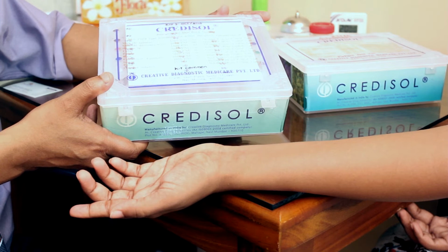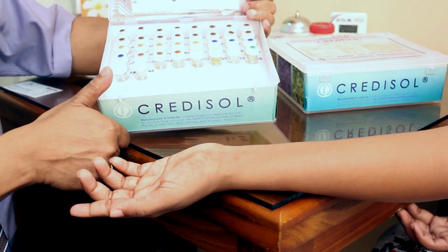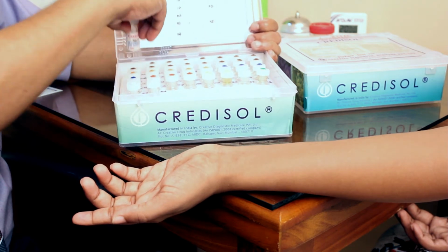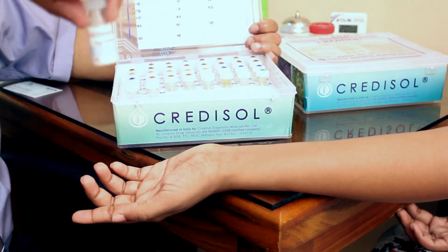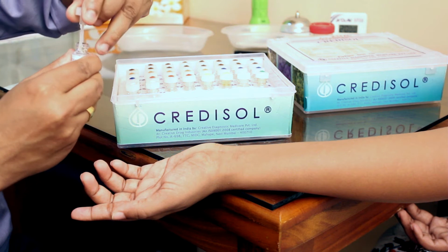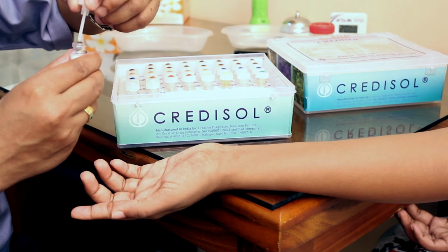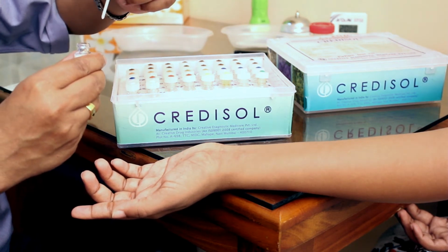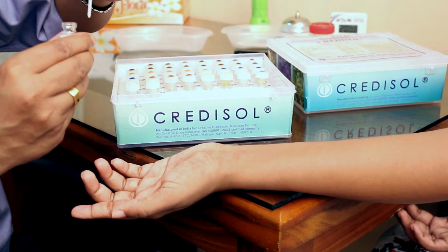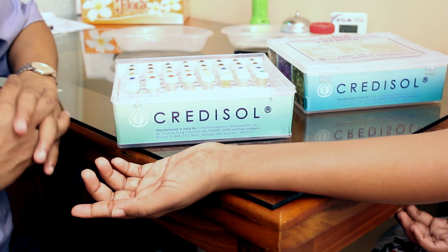This is the box which contains various allergens, and you can see the list of allergens I have marked in this form, and the allergens come in a bottle like this. In this bottle there is a lid with a pointed plastic rod, and when we take out the bottle lid, there is a drop of allergen at the tip of this plastic rod.